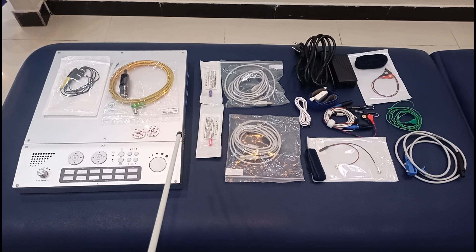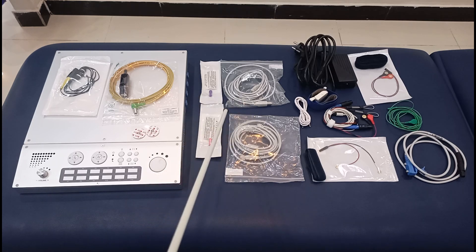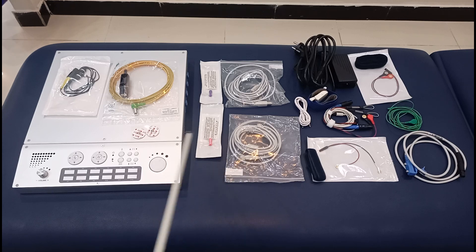There is also a goggle that has a lot of lights or LEDs on it, which is used to assess the blinking reflex. Now let's look at the interface of this machine — the ports where you are going to connect these wires and everything.